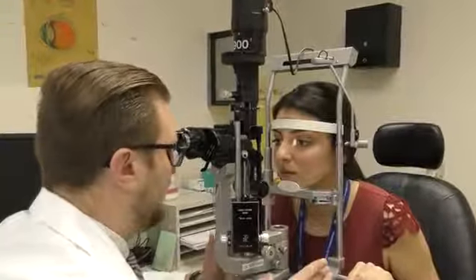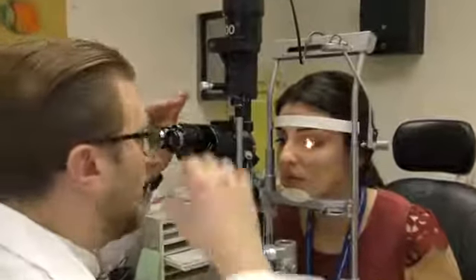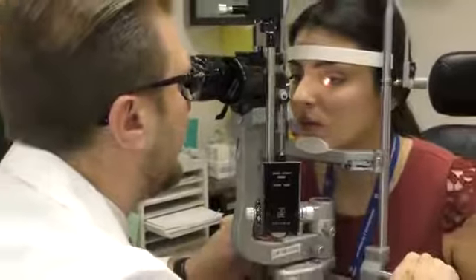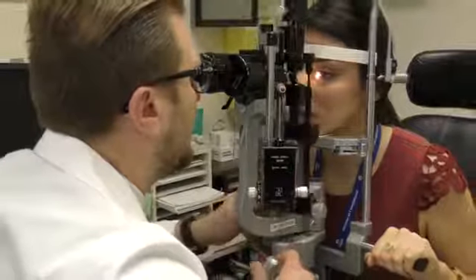It's going to be blurry when you first look through, okay? I've adjusted again for my pupillary distance and my prescription. And what you do is you want to, again, get in position, like I told you, the two hands, and move in very slowly, okay? And you're going to see that it'll be blurry, blurry, blurry, and then you'll see it'll come into focus. Right now I'm focused actually on her eyelashes, and I can see them in great detail.